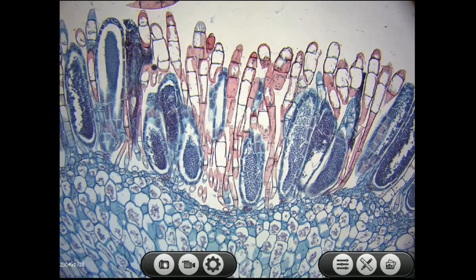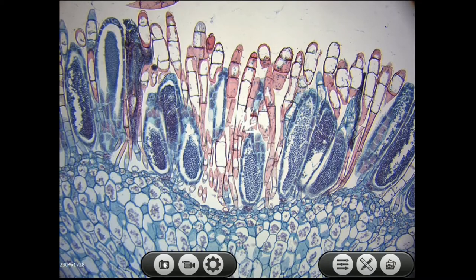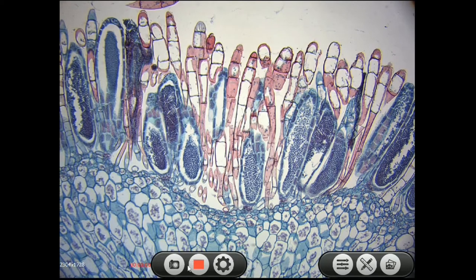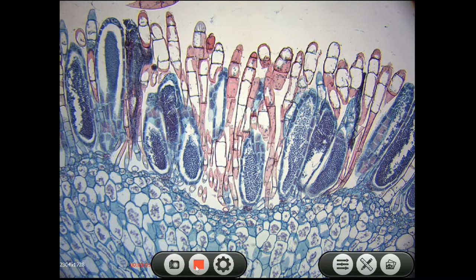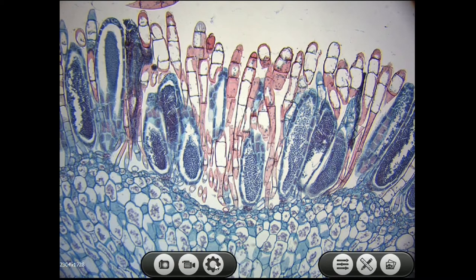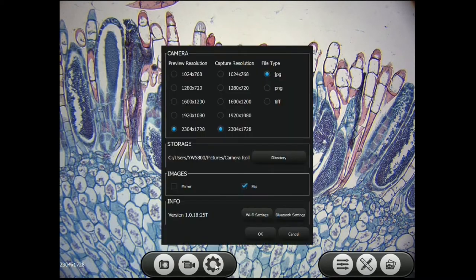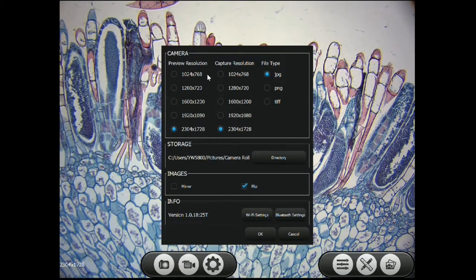To capture an image, press the camera icon. To record video, press the camcorder icon. To stop, press the stop button. To access your settings, click the settings icon.